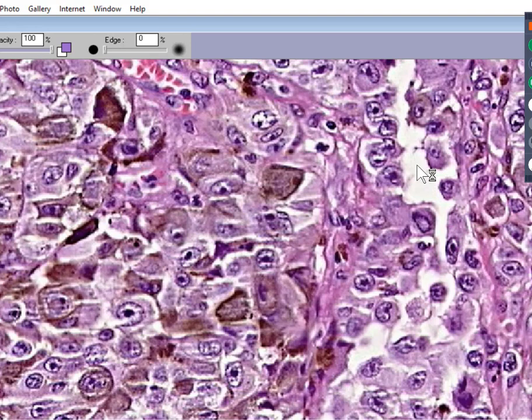Now, even though the pigment just by itself does not have to be melanin, what if they are arising from the cells of the skin that normally have melanin pigment? So these are malignant cells that are loaded with melanin, and I think you probably know already what the diagnosis would be. This is a MM. This is a malignant melanoma.